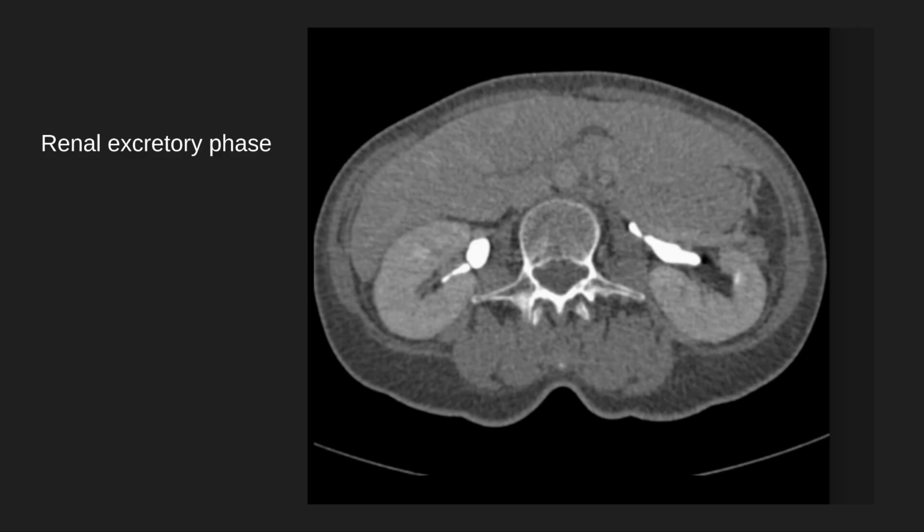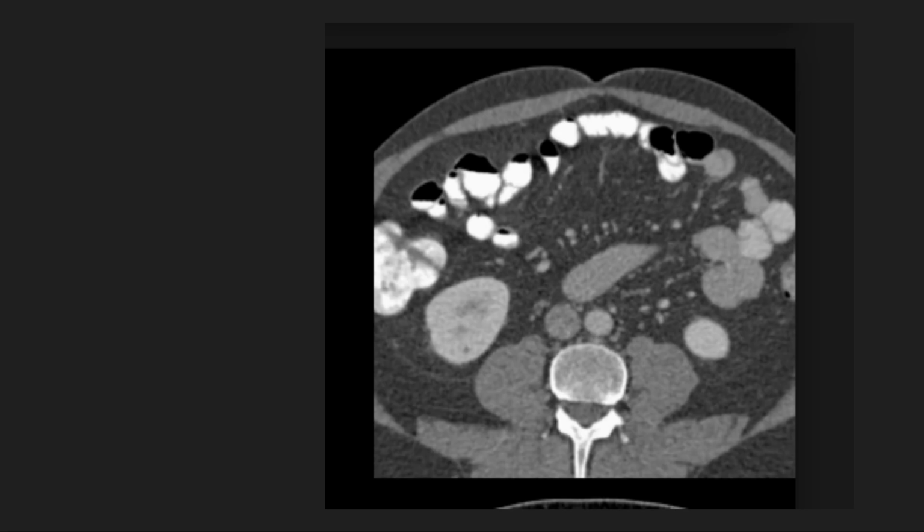So these were all examples of the phases. When you look at PACS and you look at all the different images, no radiologist will determine his diagnosis based on one phase. He'll have multiple phases accordingly. And of course, this is all for IV. What about this one? You can notice here you have the small bowel. The small bowel is composed of contrast and gas. So in some cases, you might give a patient oral contrast. So this is a standard oral contrast. You might do this to visualize the bowel, if there's any abnormality going on in the bowel.